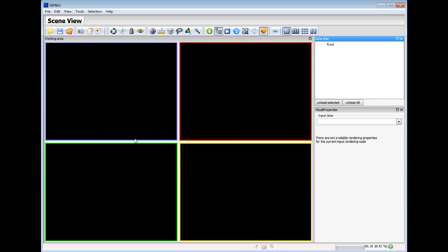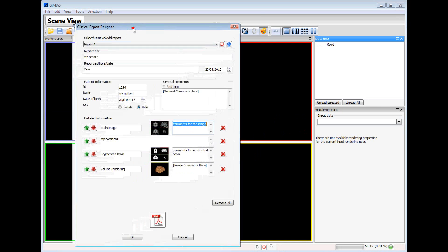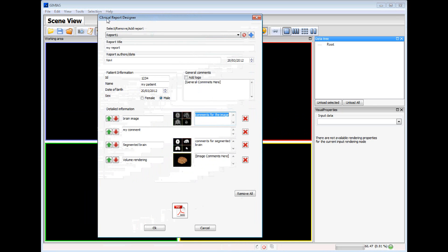In this video we will see how to create a clinical report using the clinical report plugin. The first thing we will do is to create a clinical report using the clinical report designer.